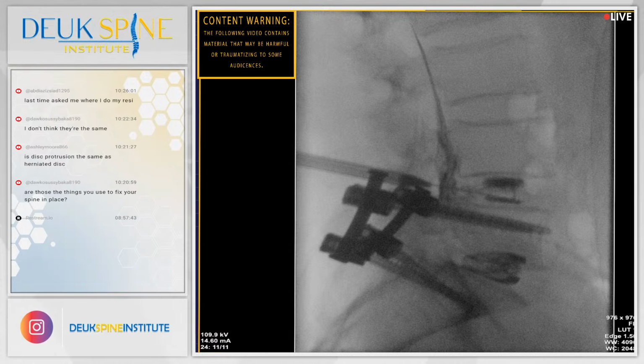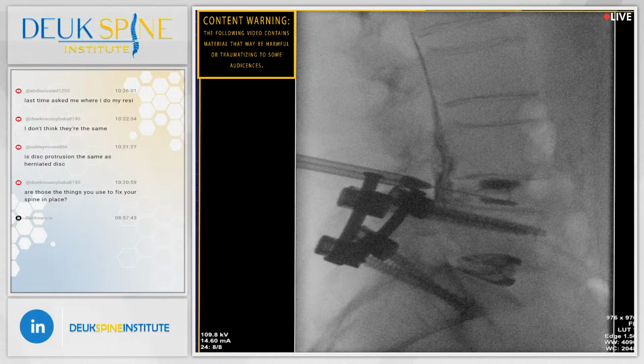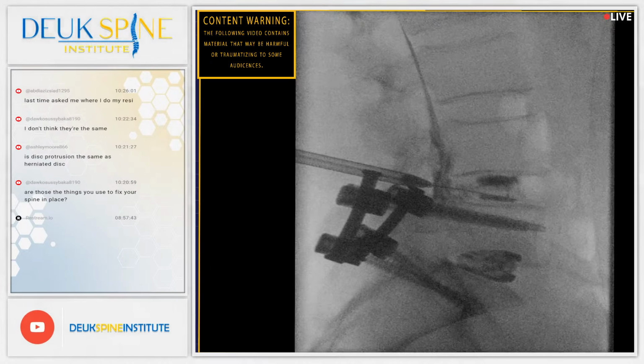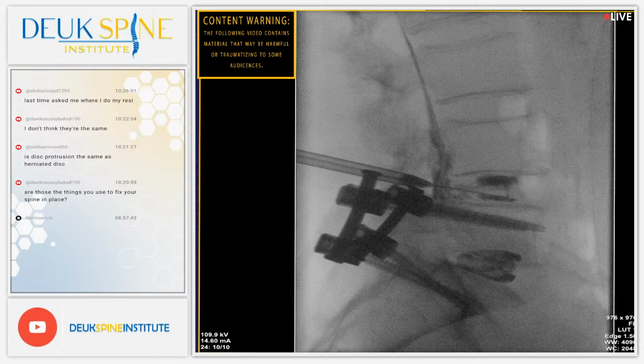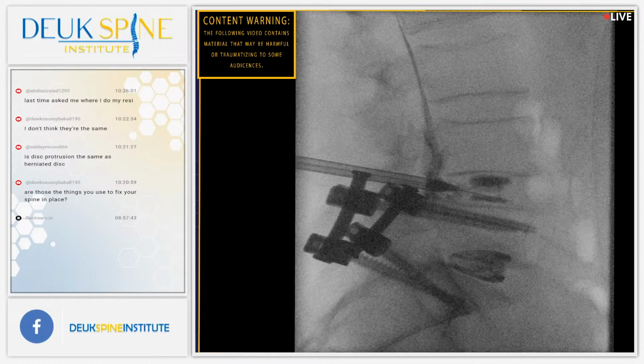He came to us with a fusion, and now he's having problems from the fusion. So he has what's called adjacent segment disease. Pretty much everybody that has a spinal fusion is going to have problems above or below the fusion. He had both above and below. So if he hadn't had his fusion, I don't think he would have any of these problems. Yeah, that's definitely a painful disc.